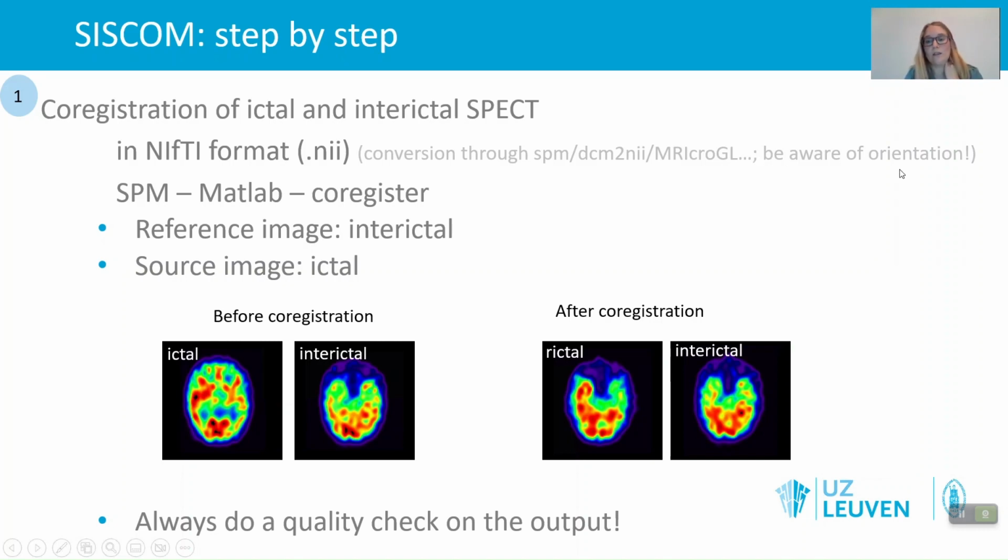The only thing, if you start doing this, is that you need to be aware of the orientation. You need to be sure that during these conversions, left-right doesn't flip. For clinical scans, this is generally not a problem. I worked before in preclinical studies with animal scans, and sometimes, in the microPET or the microSPECT, the orientation would flip, so you need to be aware of this.